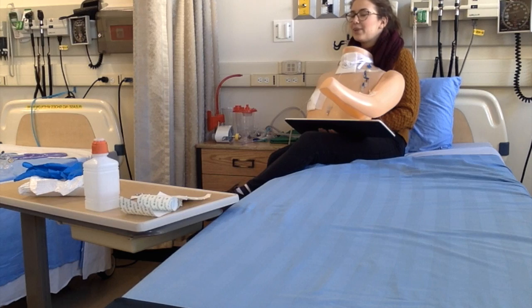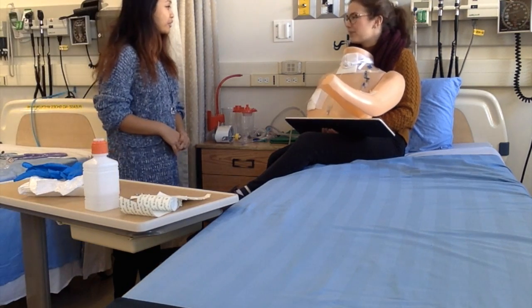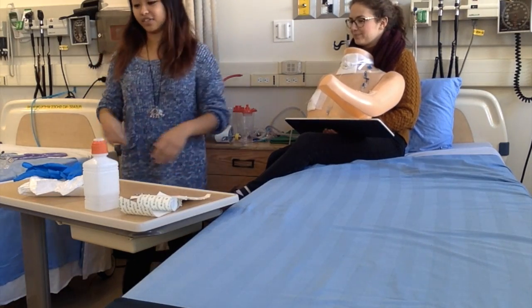So next up, I'm just going to demonstrate how to do a dressing change for the chest tube. And I have my friend Melissa here to help me out. Hello? Hi there, Melissa. How's the Tylenol working out for you? Really well, thank you. Good. I'm very glad. And would it be okay if we start with the dressing change? Yes. Sounds good to me. Okay.